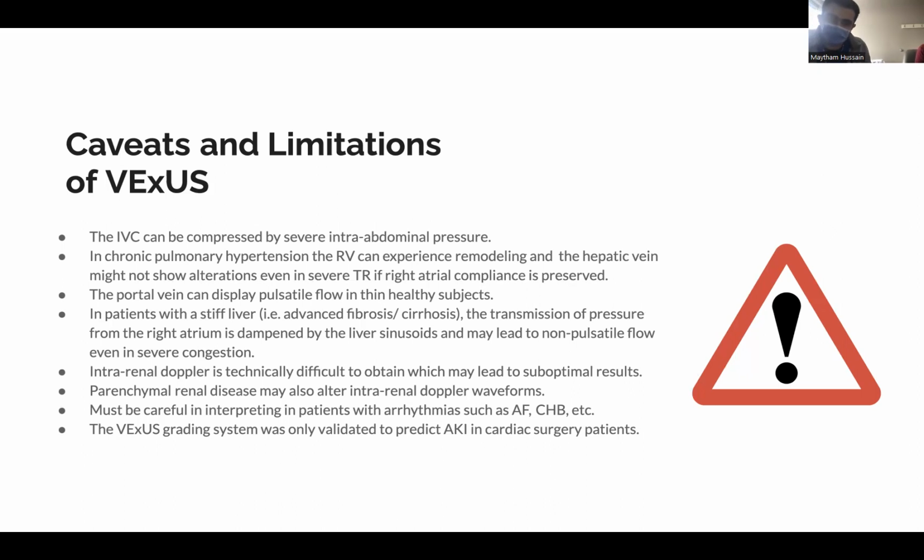And then also, what we talked about before is that the VExUS grading system was mainly validated in patients to predict AKI in cardiac surgery patients. So again, it's tough to say whether we can generalize this to the general population or not. And then probably one of the issues we encountered most during the time doing VExUS is interpreting it in patients with arrhythmias such as atrial fibrillation, complete heart block, and so on. Sinus tachycardia, because sometimes you get fusions of waveforms or you get incomplete waveforms.